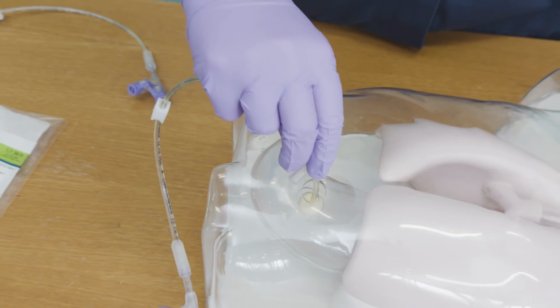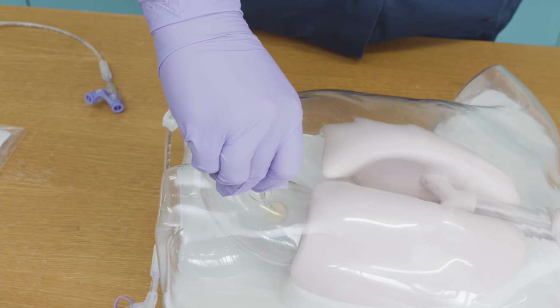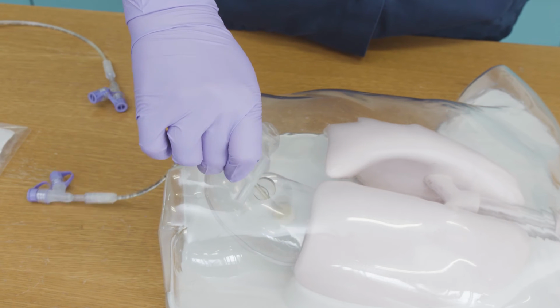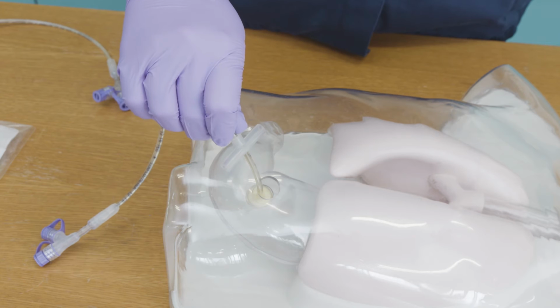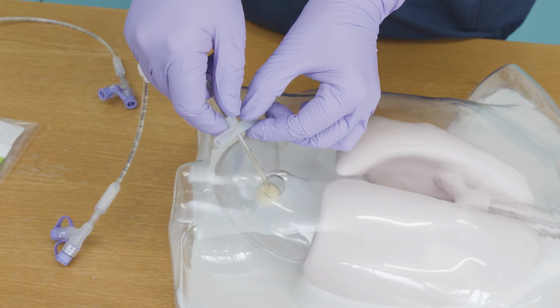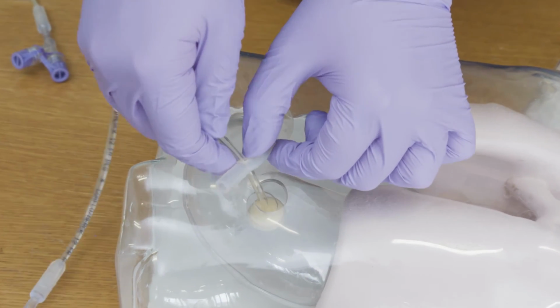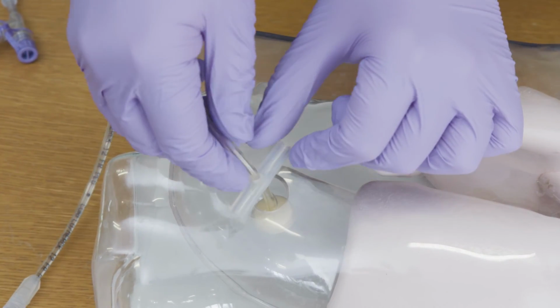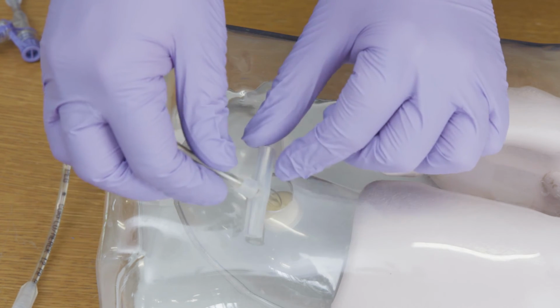Advance the tube into the stomach by 2 inches or 4 centimetres, then rotate the tube 360 degrees. Pull back gently on the tube until you feel resistance from the internal bumper. Move the Tbar and cuff back to the correct position, which is approximately 2 millimetres from the skin. Note that the Tbar shouldn't be too tight or too loose.